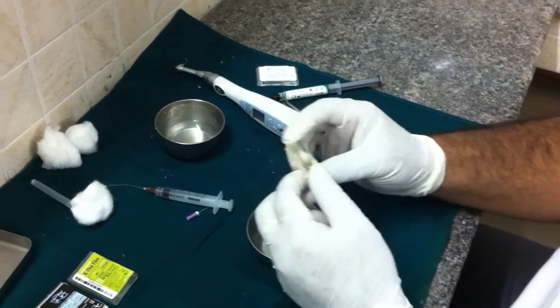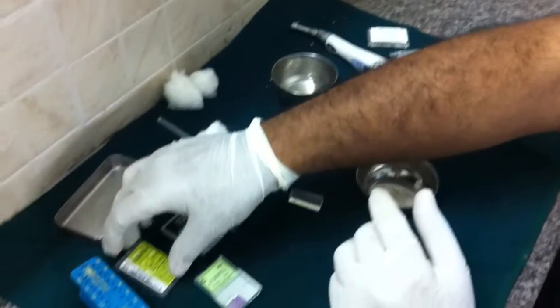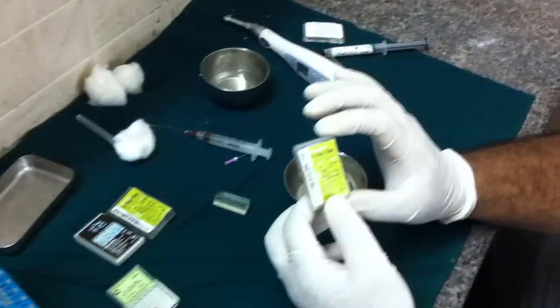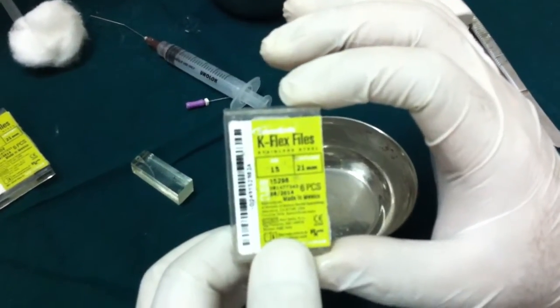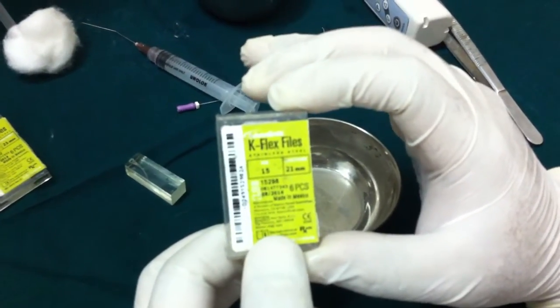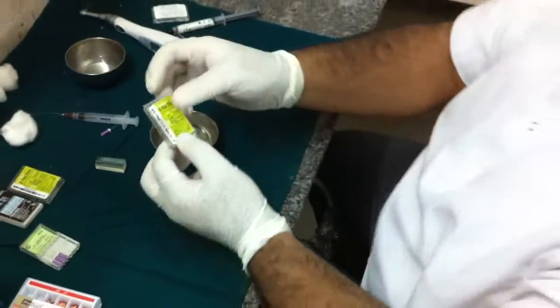Now, following orifice enlargement, the next step is establishment of glide path. Here I would prefer Sybron's K-Flex file for the simple reason that K-Flex files have less chance of ledging or transporting the canal.